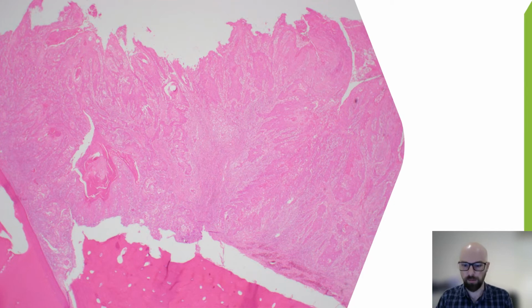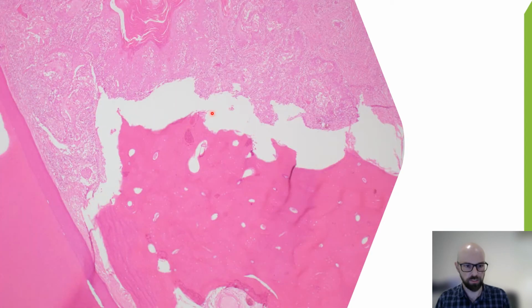A potential trap for assessing for bone invasion is getting cortical erosion only. So we've got a case here, and usually, like with this instance, you get cortical erosion adjacent to teeth or around the tooth socket. So we've got tooth here, we've got the tumour up here, and then cortical bone here. And then zooming in, we can see that it really is just kind of cortical erosion. We're not seeing tumour getting down through the cortex into the medulla. So this doesn't count as bone invasion.